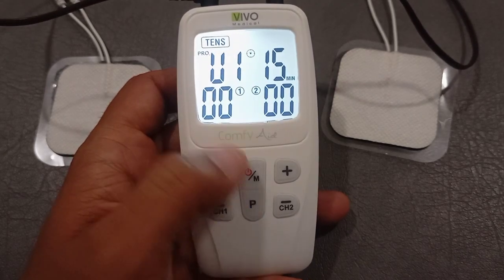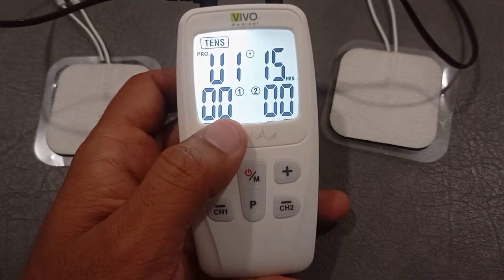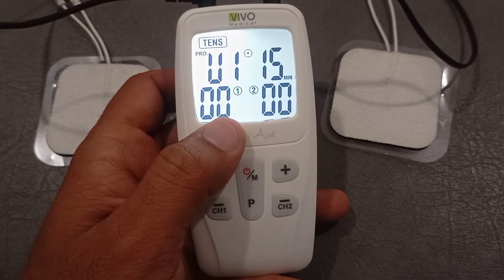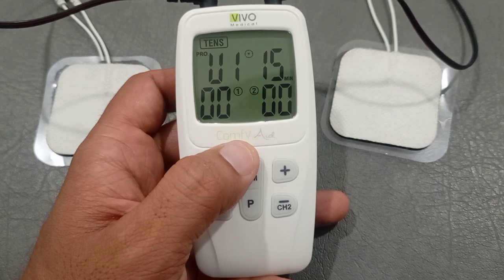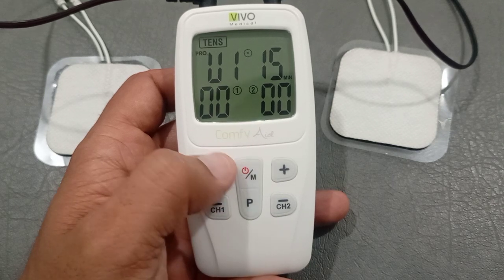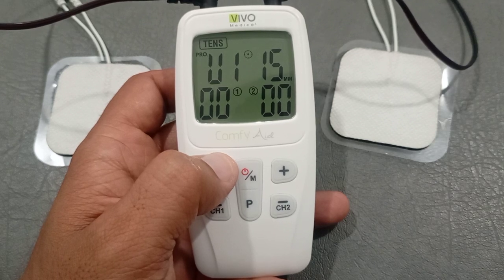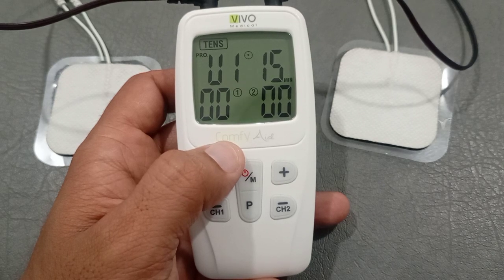So let's discuss the first program that we need to use. You need to understand that there are basically 3 types of TENS. Number 1 is high frequency and low intensity. High frequency TENS is the TENS in which the stimulating frequency is more than 50 Hz, but the intensity is minimum perceptible. The second mode is low frequency and high intensity.